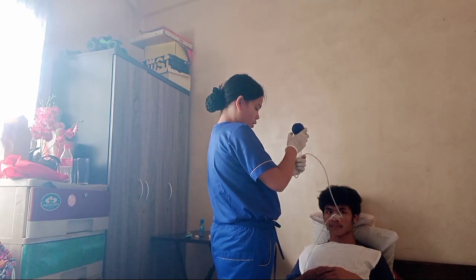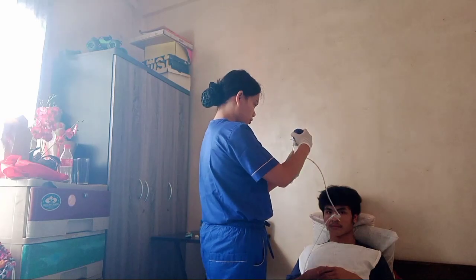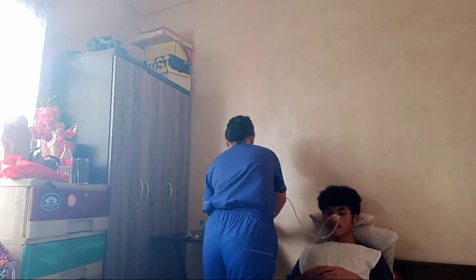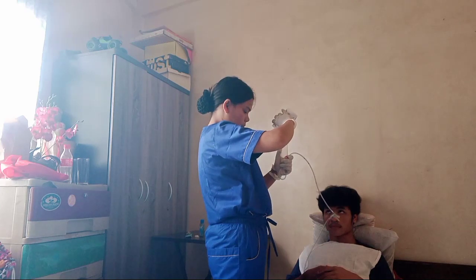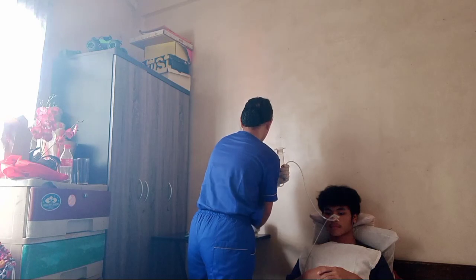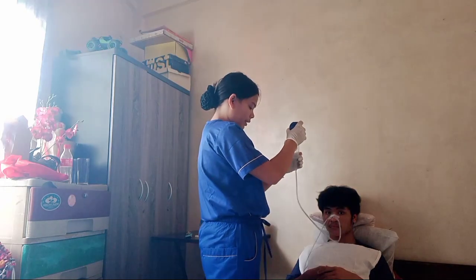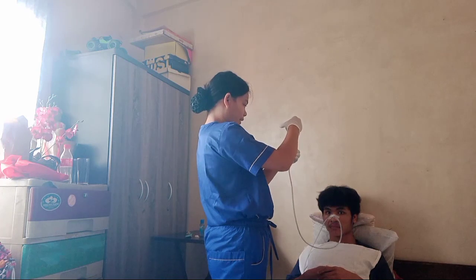And check, flush with a minimum of 25 ml of water. Then, administer feed via gravity or pump at prescribed rate.